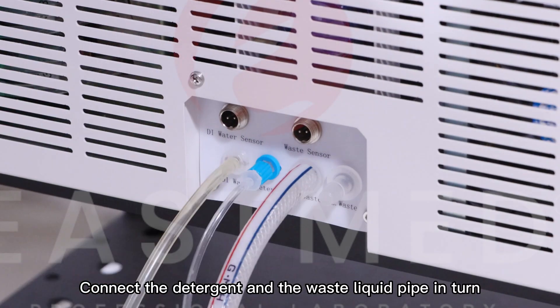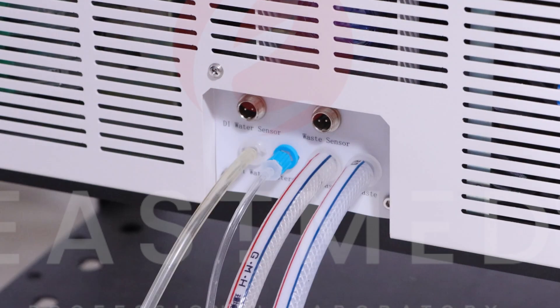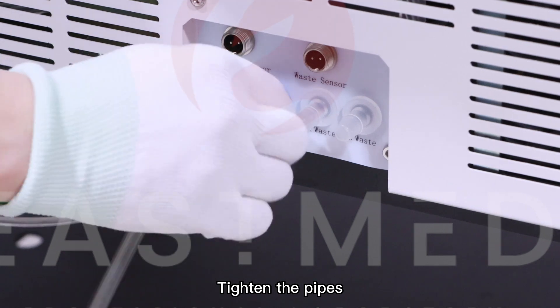Connect the detergent and the waste liquid pipe in turn, then tighten the pipes.